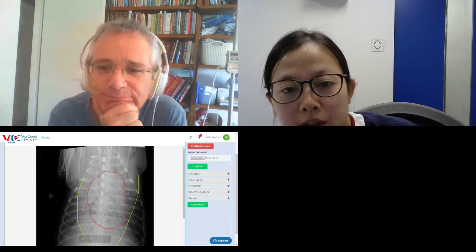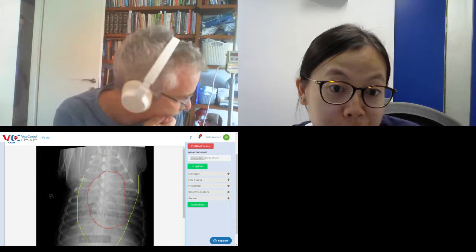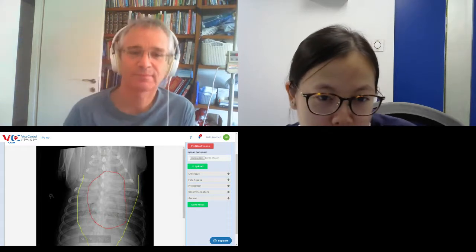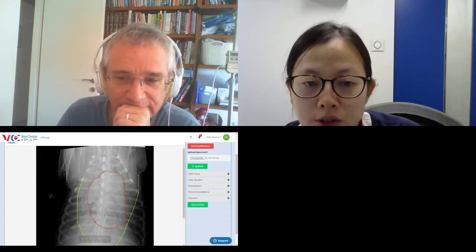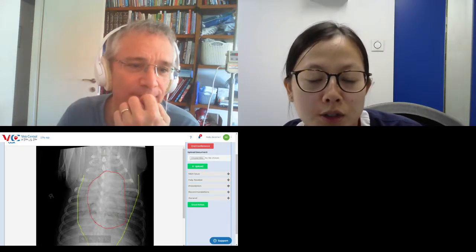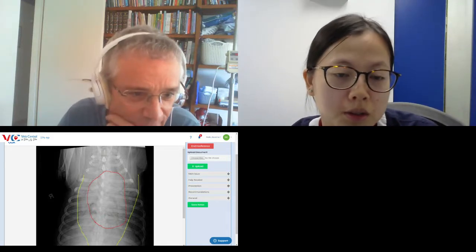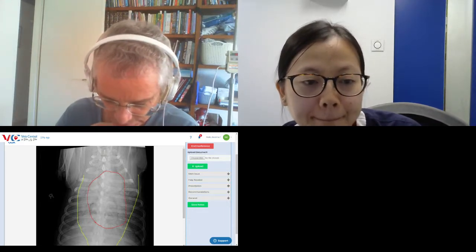Okay. But I think I'll just say I have managed to get these views on the echogram, and maybe if you can just analyze and tell me what you find. The last shot was like the money shot for the pulmonary hypertension. So I see. Focus on that, and then finally we talked about the X-rays as well, and the X-rays were, I think, fairly unremarkable. It's mostly just showing that the right-sided heart may be a little bit enlarged, but otherwise the lungs are fine. Yeah. Okay.